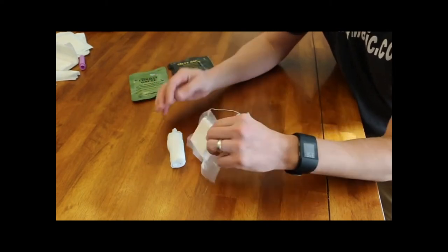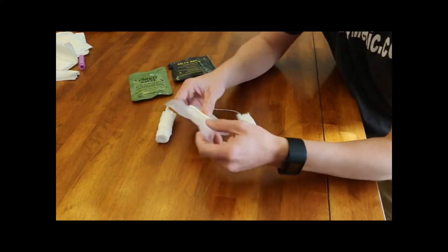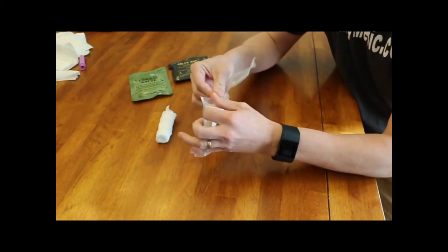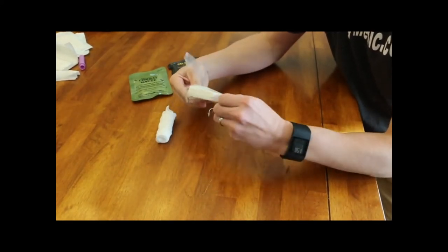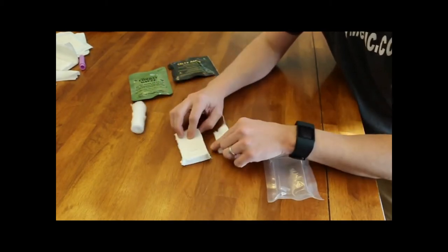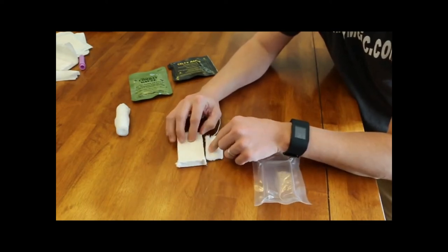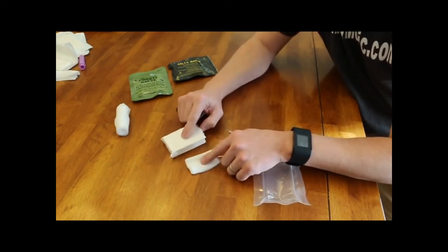Let's talk about the compressed gauze. It's a little bit more expensive than the cling, but let's open it up. Even by unrolling it to make it not so dense, you can see a huge difference, guys. That's compressed gauze compared to the tampon.